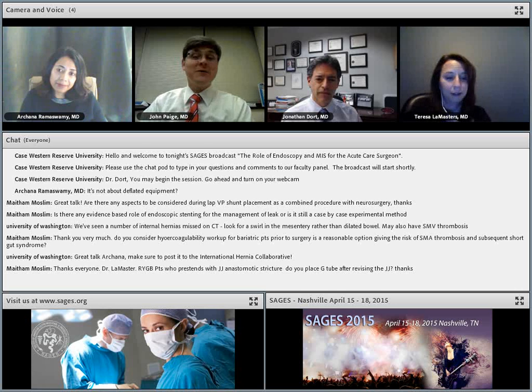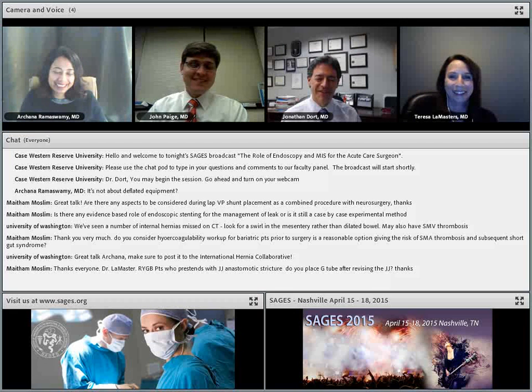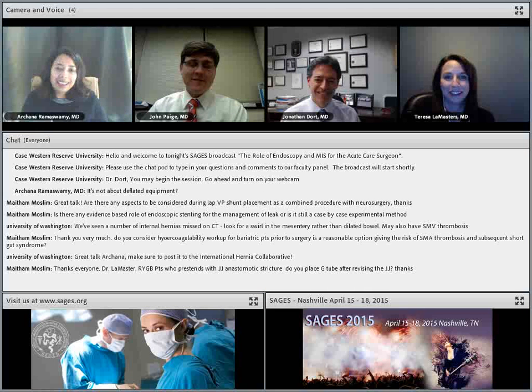All right, so how many people close 5 millimeter ports? I don't. Nope. A picture like that, I think I should think about it, but I don't close that fascia. I never do.